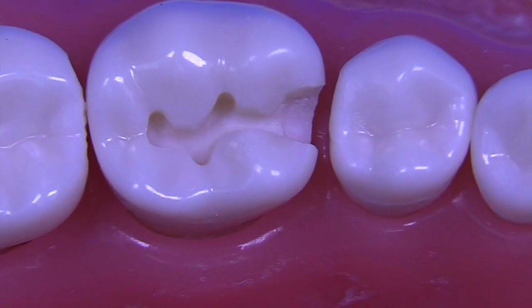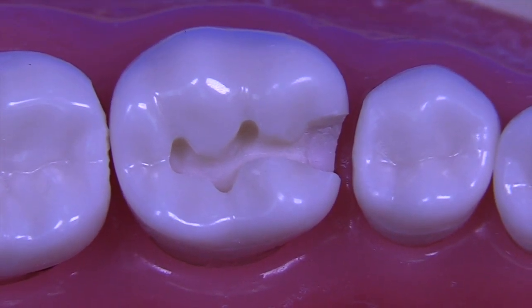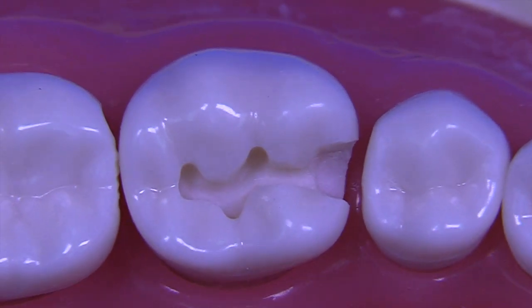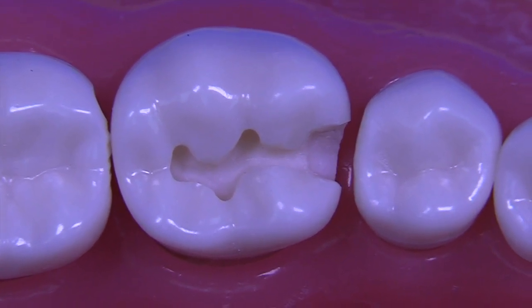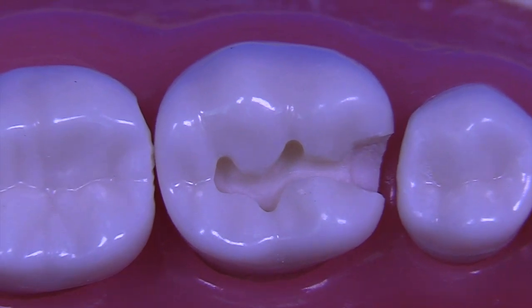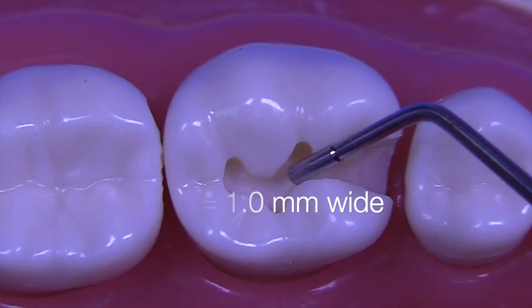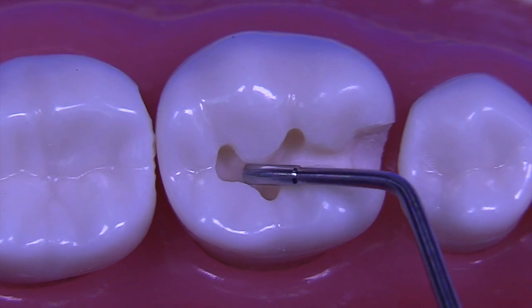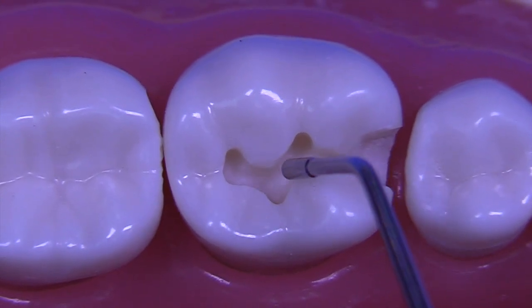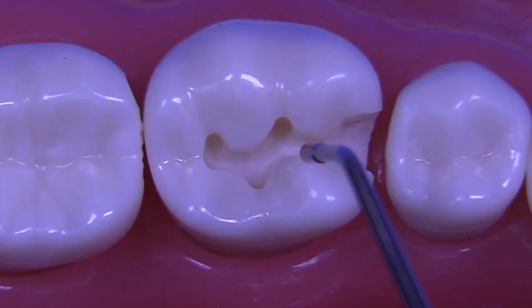The size is quite nice. If we were to look at the width of the outline form, utilizing an RGS 3-4 instrument, we'll be able to see how wide the isthmus is. And let me show you what that looks like. So this is the 1 millimeter RGS 3, and you can see that it's really nicely in that 1 millimeter range. It's a little bit more here, maybe a little bit less here. Between these two cusps, a little bit more in here, but this one is just right. So I think you've done a very nice job with the size of the outline.